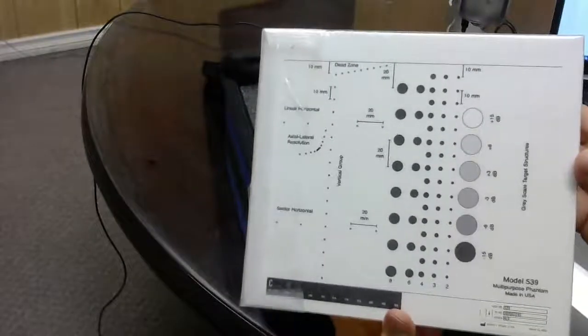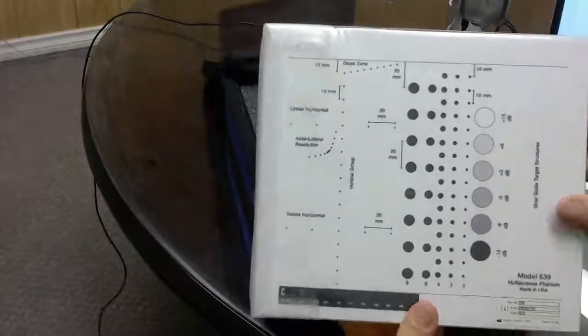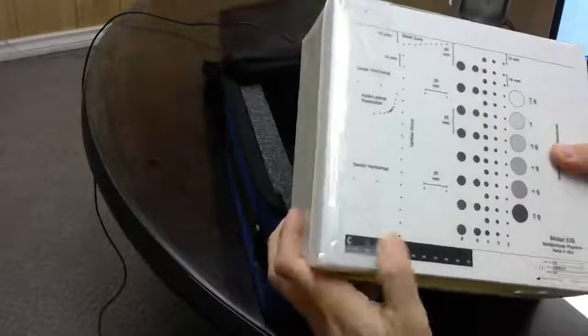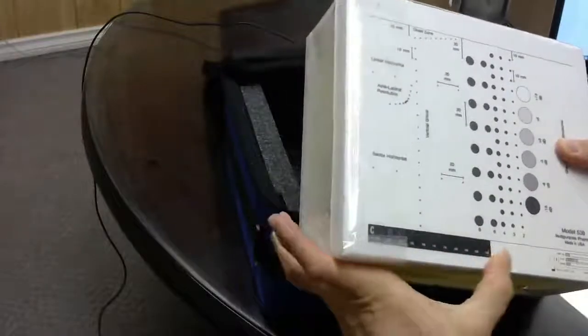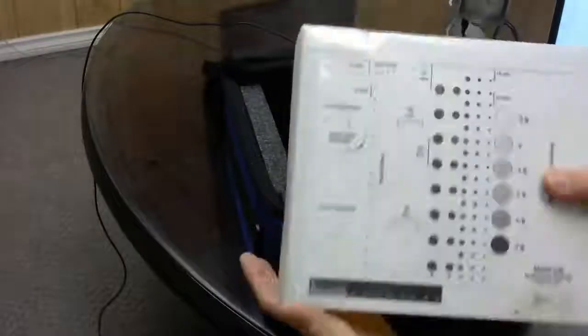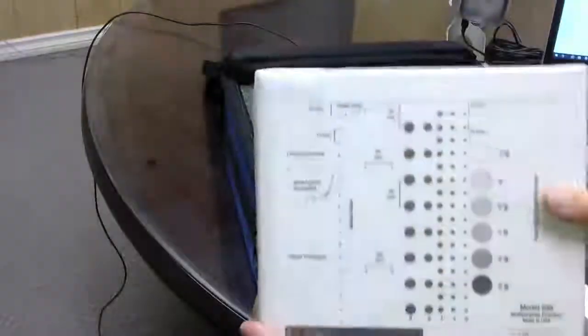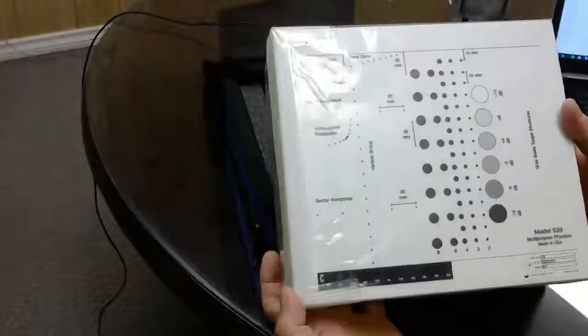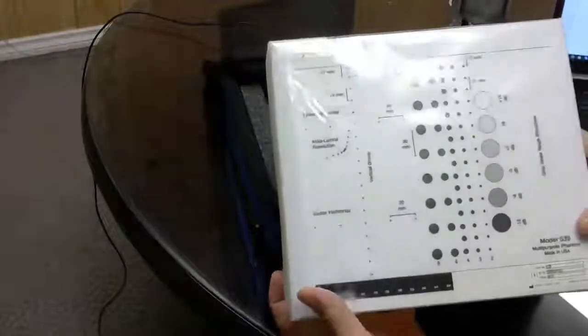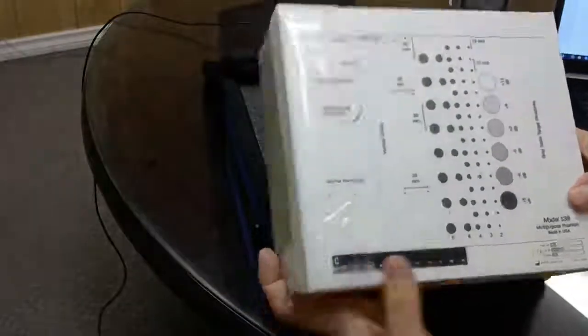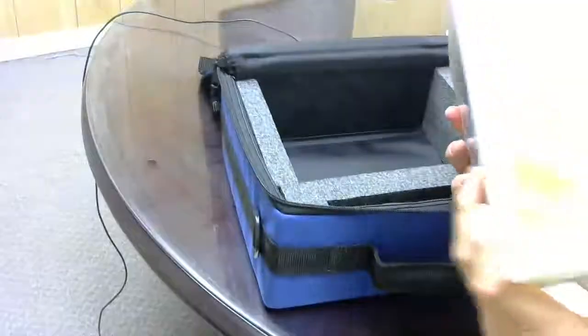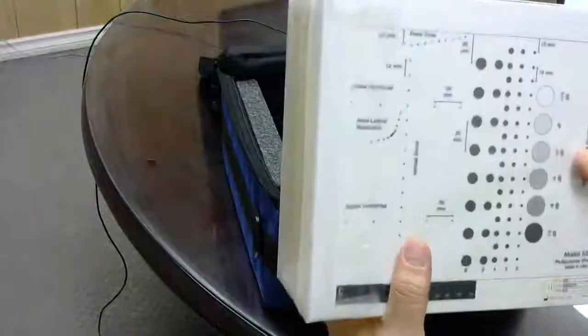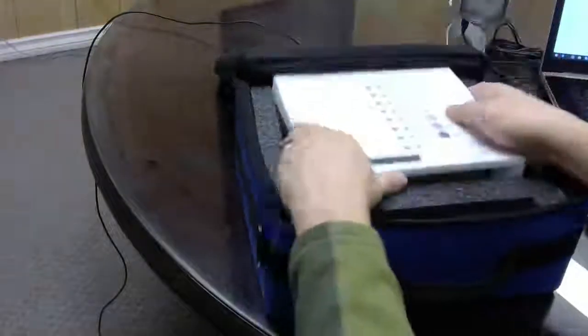So this is just a quick unboxing of the ATS model 539 ultrasound phantom. Steve signing out, thanks.